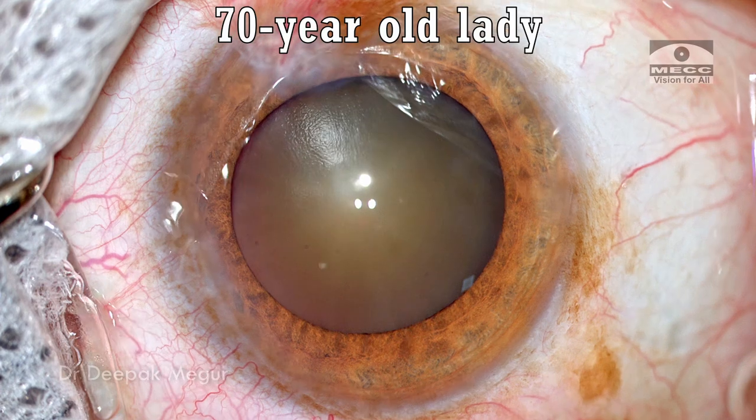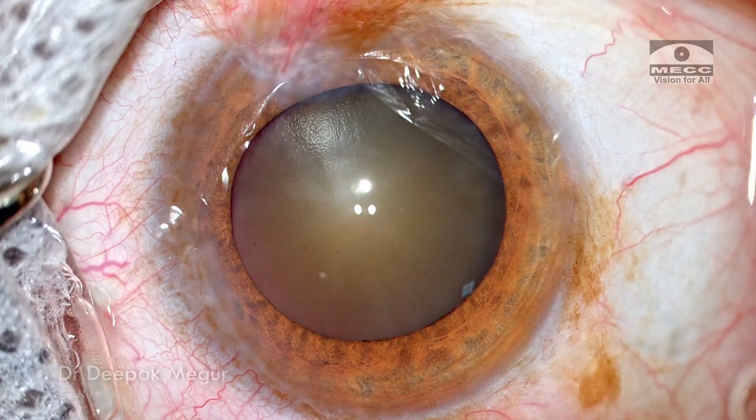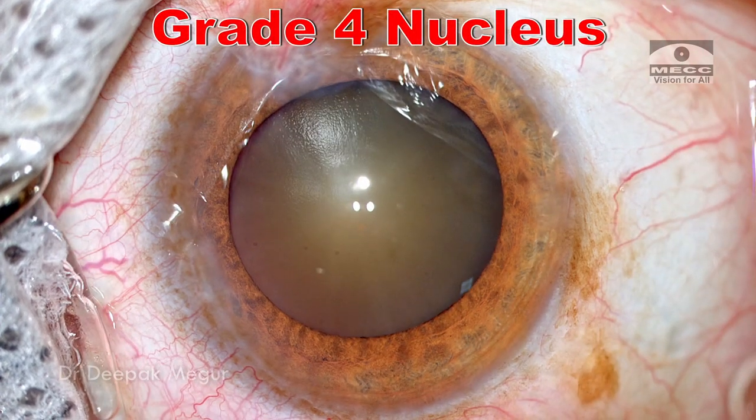She is a 70-year-old lady who has a dense brown cataract, which is approximately grade 4 nuclear sclerosis.